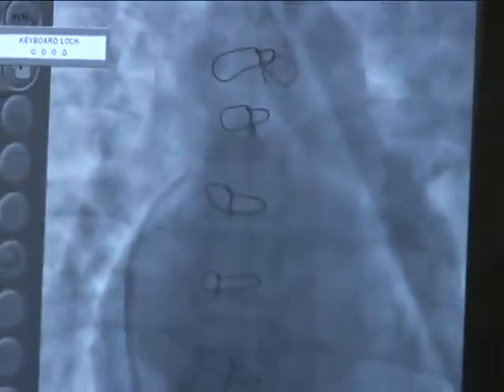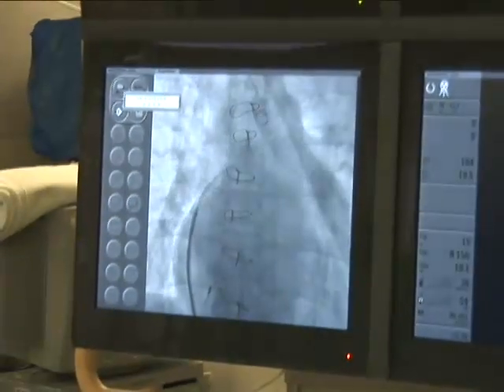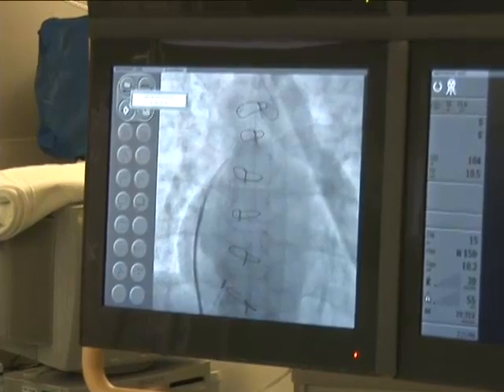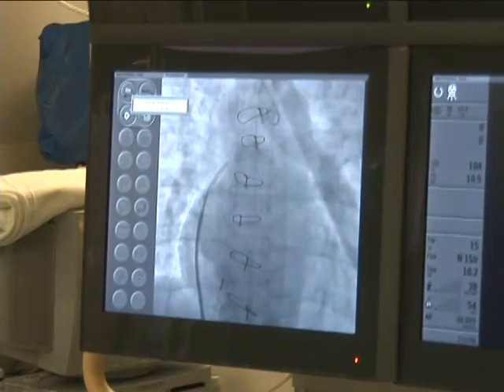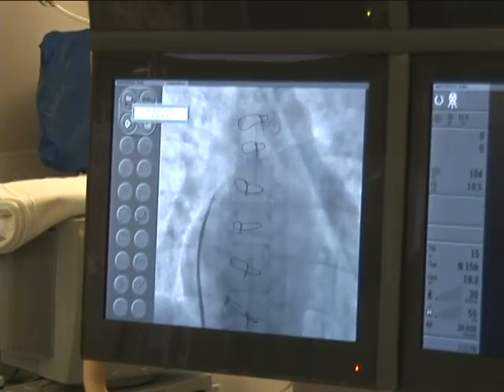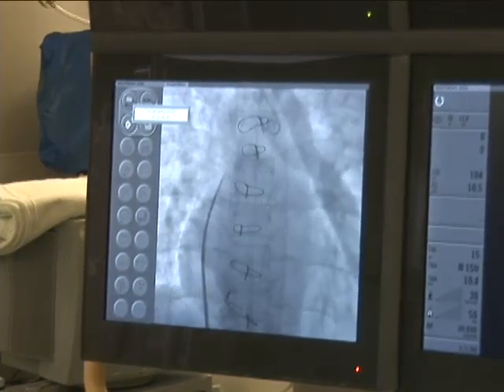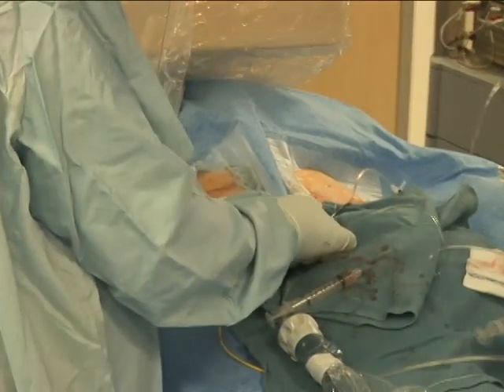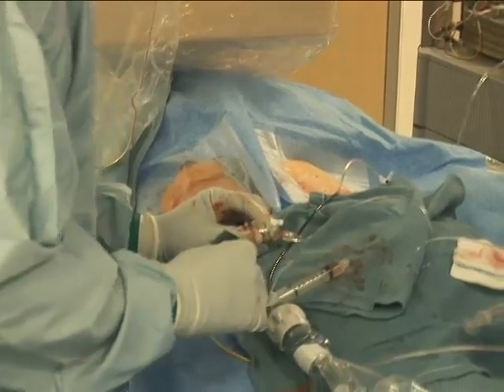Under fluoroscopic guidance, it is advanced through the dilator until it is 1 to 2 centimeters from the tip of the dilator, taking care not to advance it outside the dilator using fluoroscopy and the previously obtained assessment of the needle measurement. Gentle rotation of the needle should be done while advancing it to ensure the dilator maintains its position pointing to the patient's left side. The stylet is removed when the needle is in position. An RA pressure recording should be present.